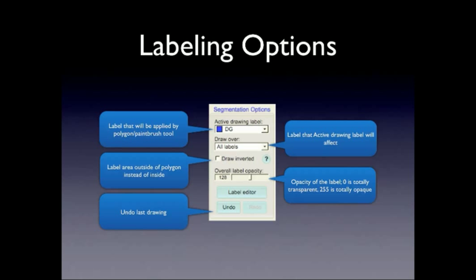So for instance, if you have, like we have the DG and the CA are very close together. And if you want to draw in that SRLM between them, you don't want to have to pick out each voxel. You can just sweep the brush over. So if you set draw over to just draw over clear voxels, you don't have to worry about overwriting anything. Another example is say you use the, you label dentate in all the slices, but you use the wrong label. You can just quickly select the correct label as the active drawing label and draw over your old label and it'll just replace it. So this will be more clear in the example. I know that's not the best description.